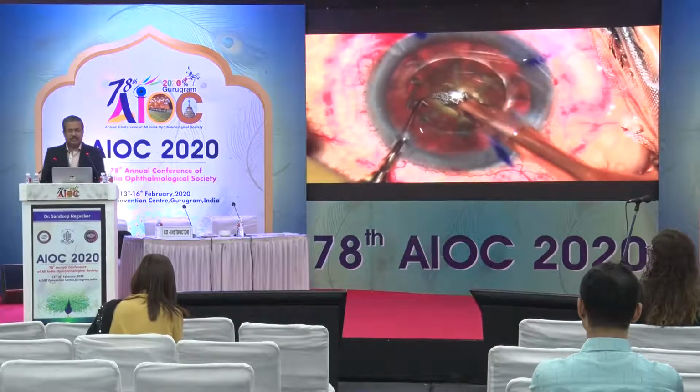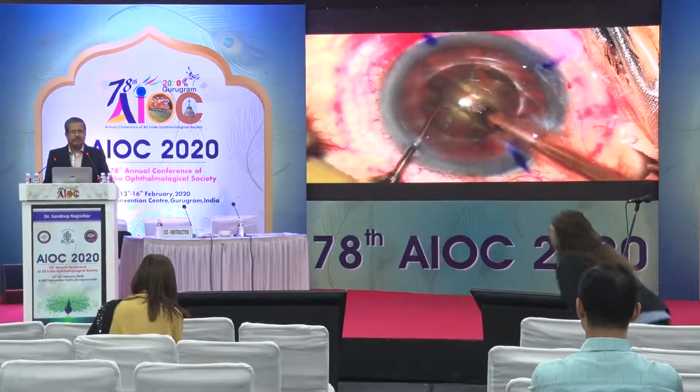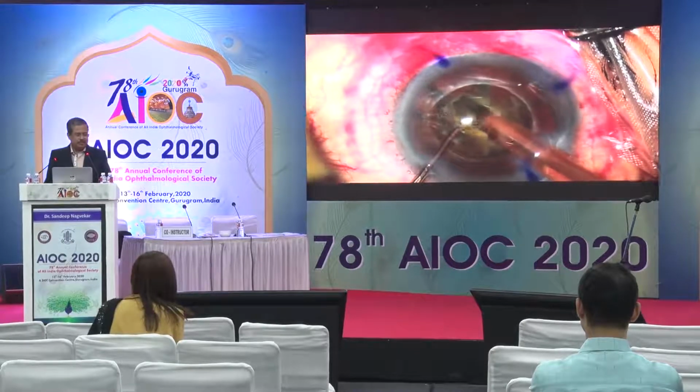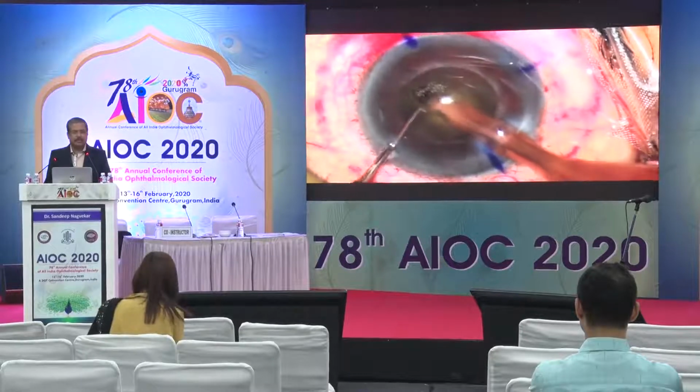Now, this is the first case. This is a straight grade 4 cataract that we are doing. And the first thing that is very important in all these cases is that you must make a long, deep, and wide trench. Remember, one should not be afraid of trenching deep in these cases because most of the time the cataract is very hard.